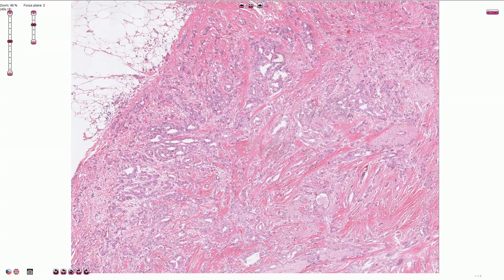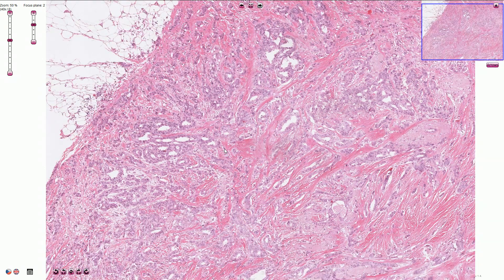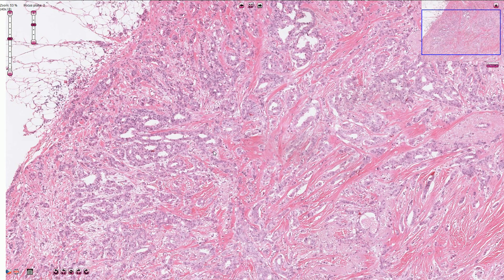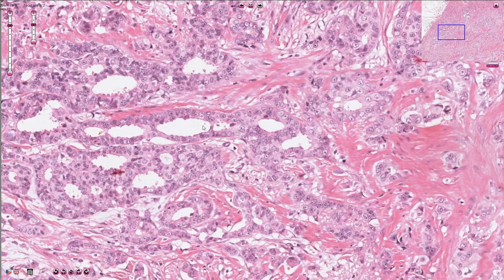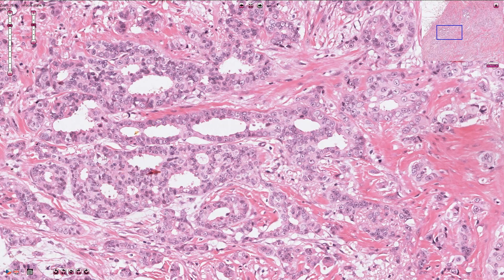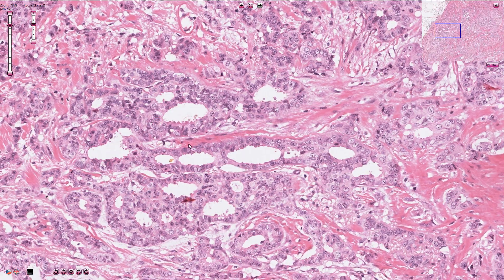Here we are looking at the breast tumor, which is composed of invasive glandular, tubular, and duct-like structures. These invasive ductal structures are surrounded by fibrous stroma. The cells have round oval-shaped nuclei with vesicular chromatin and quite prominent nucleoli. These cells create duct-like structures and sometimes also cribriform structures. This is the typical appearance of ductal carcinoma of the breast, which should now be called adenocarcinoma of no special type, or adenocarcinoma NST.